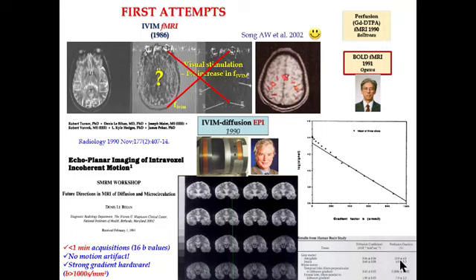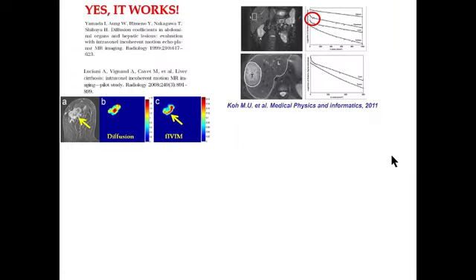I'd like to point out something which has not been really looked at so far, that we found anisotropy in the IVIM effect, something which now we would like to investigate more. I know some groups have done it, but there is some anisotropy that we should investigate. So yes, it works.